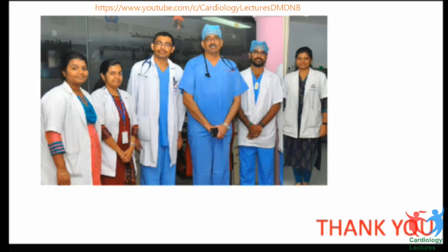But most of the time, it is very difficult to get a center position, because once you have a 6 millimeter left main, 5 millimeter left main, it is very difficult to get it. It is one artifact, and unless it is a small vessel where you can engage your catheter coaxially, it is very difficult to avoid this artifact. The most important thing is you have to recognize this. If you measure the dimension, it will be 6 millimeters, but you should not select a 6 millimeter balloon. It is actually a 3 millimeter or 3.5 millimeter vessel. So that is the message. You should recognize this artifact and avoid oversizing of your balloon or stent.